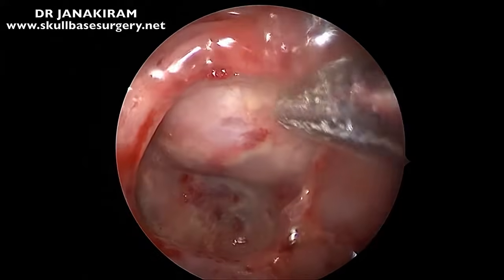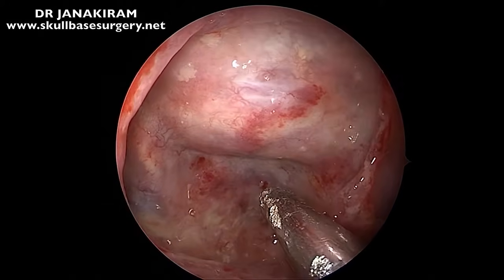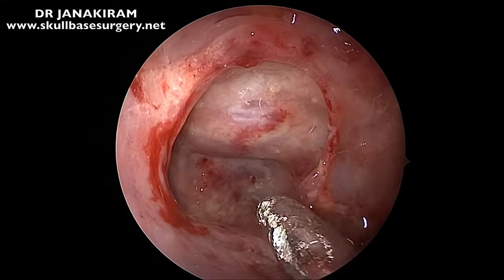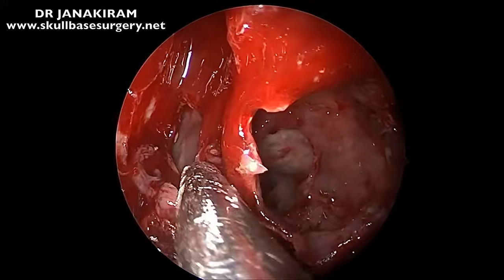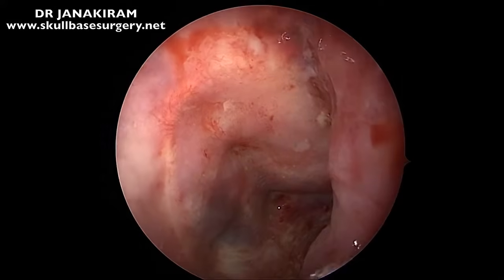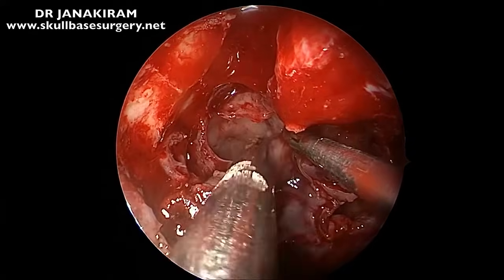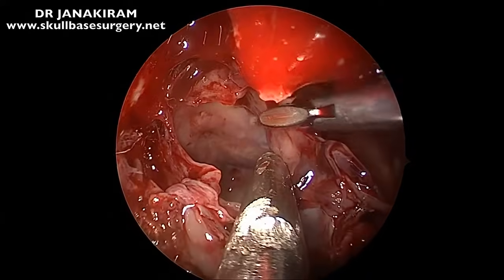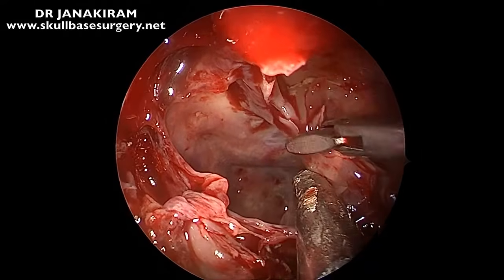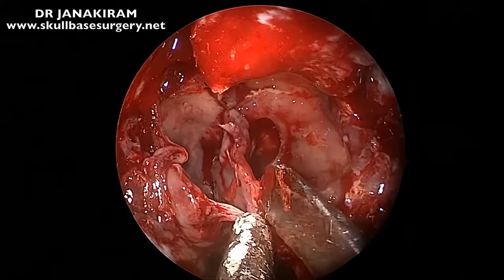You can see clearly that is the clival recess and the sella out there right in the middle of your picture, and you can see the intersphenoidal septum now, which is exactly corresponding to the CT scan. That's the right sphenoid sinus. It's not advisable to pluck the intersphenoidal septum with a shearing instrument because that is going towards the carotid. It's very obvious there, towards the left carotid.